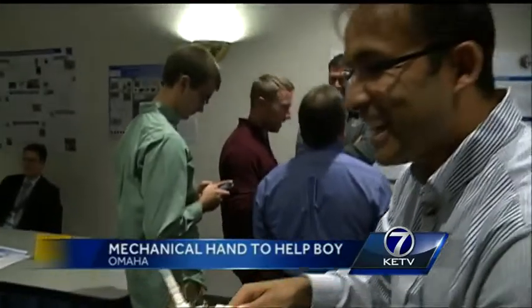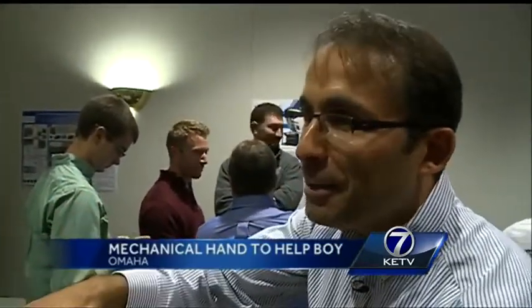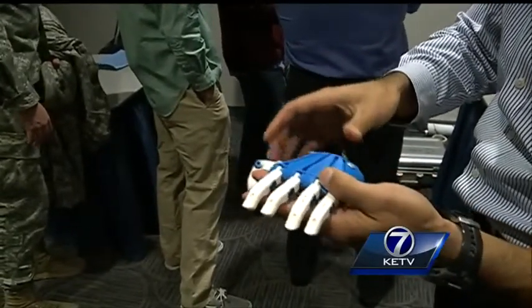If a child is using this and if they break it or if it breaks, no big deal — we print a new part. This prosthetic hand is child-proof, affordable, and made right here in Omaha.